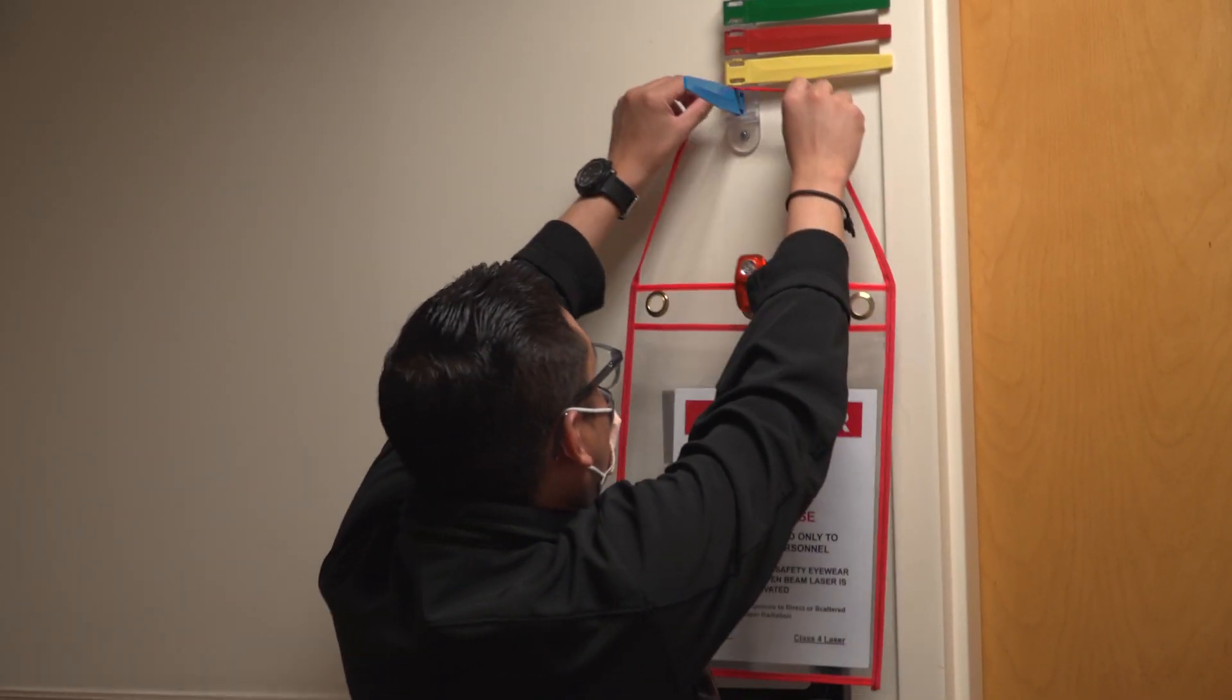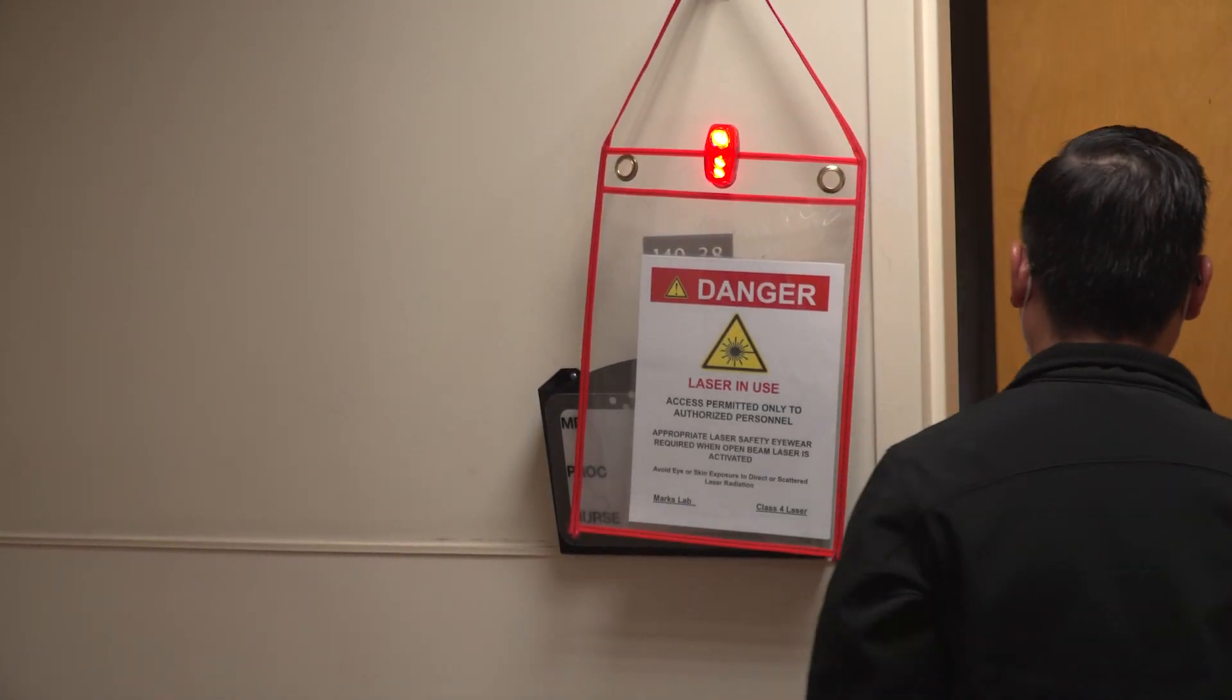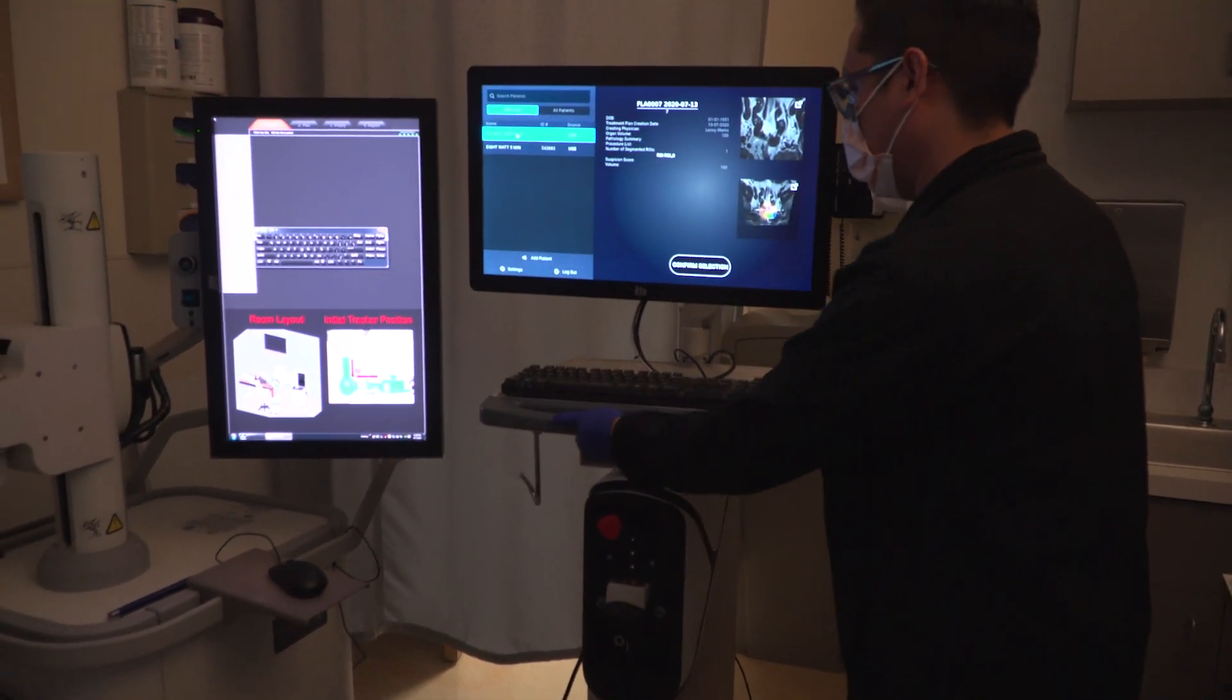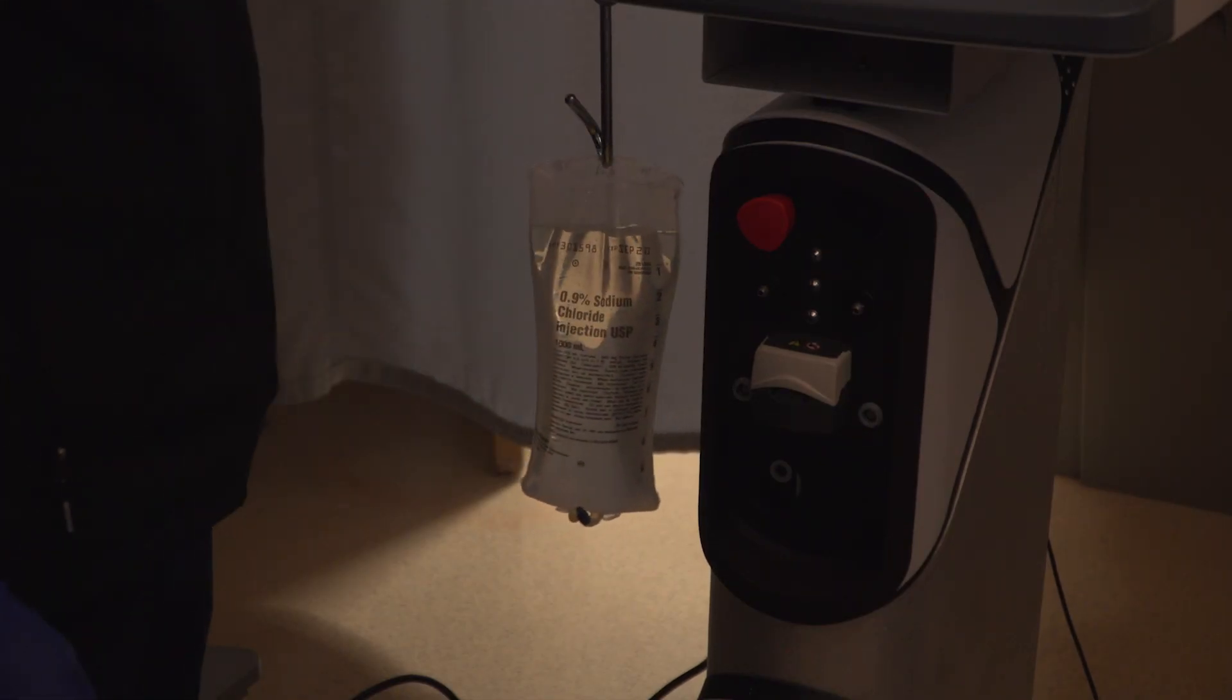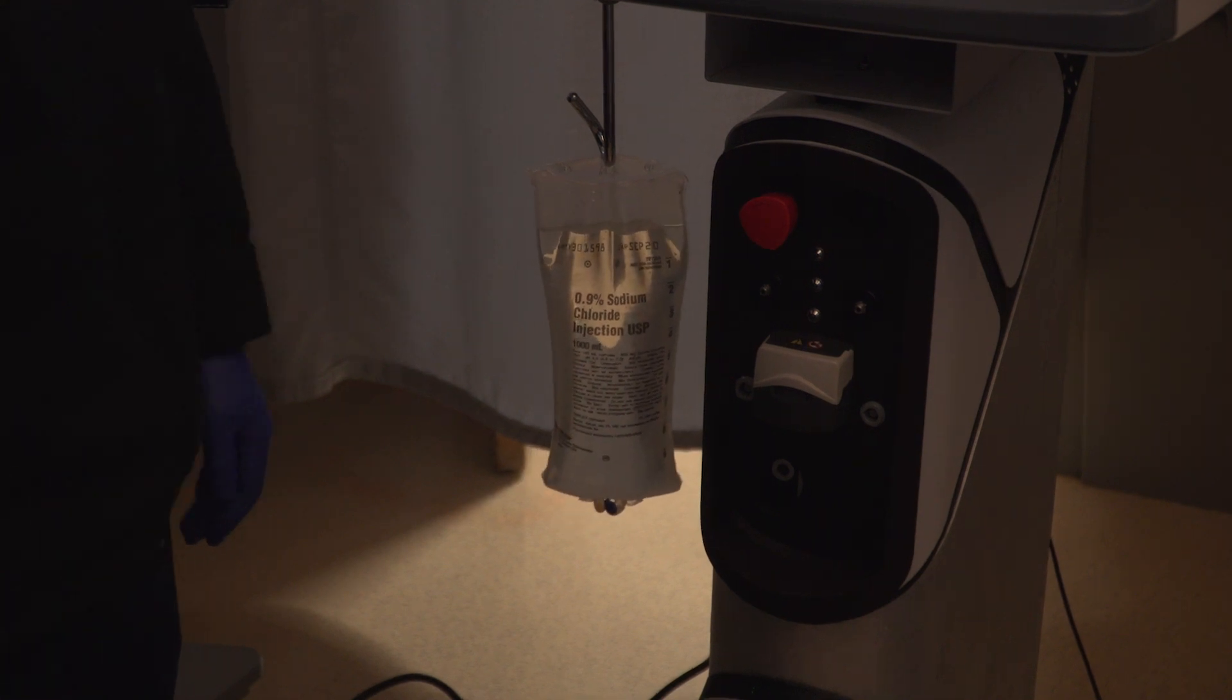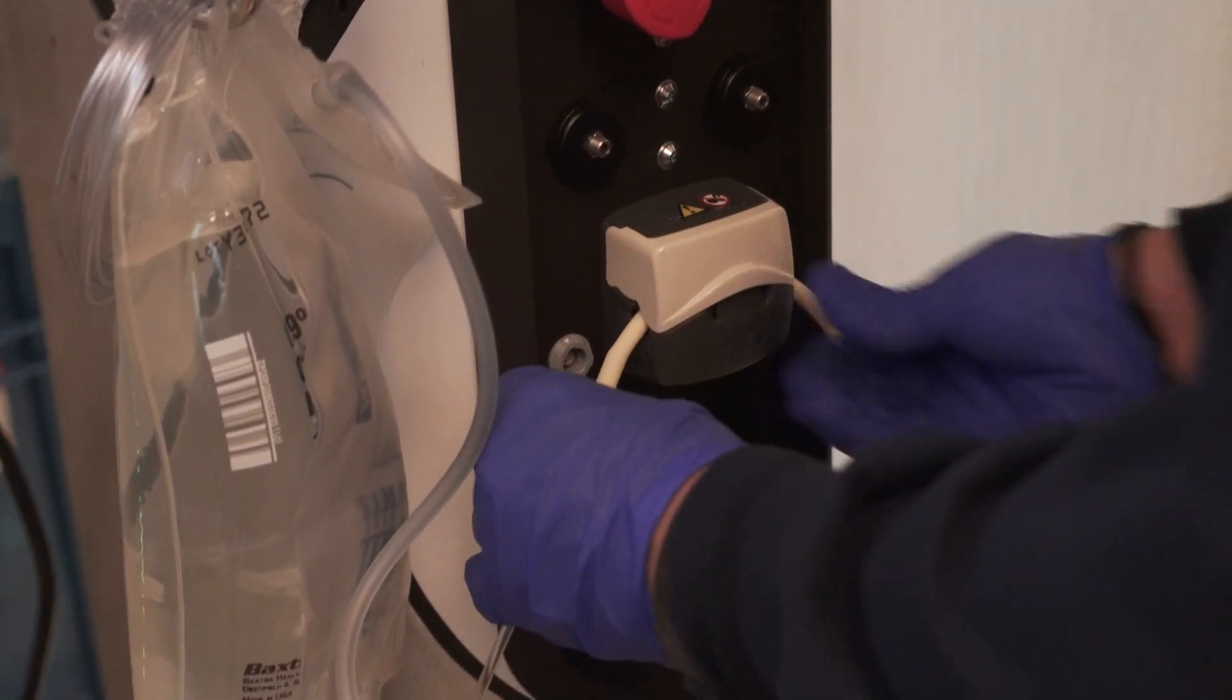In preparation for the procedure, place a laser warning sign outside of the room and minimize all non-essential traffic. While setting up the room, the Orion workstation is placed where it can be comfortably accessed. An IV bag of saline and a drainage bag are attached to the Orion workstation to facilitate later cooling of the laser fiber during ablation. The IV tubing is passed through the pump on the front of the workstation and coiled for later use.